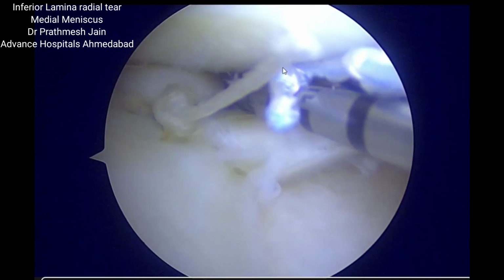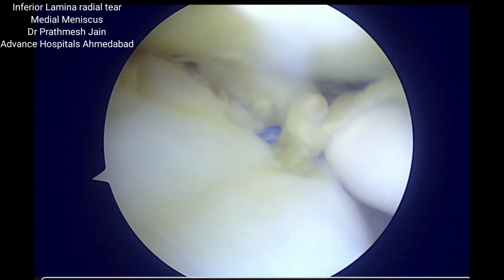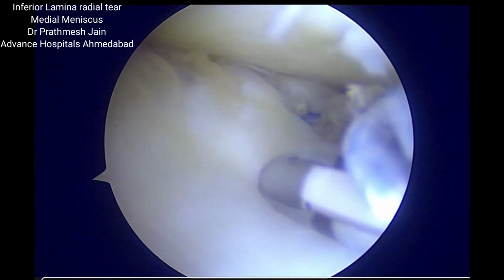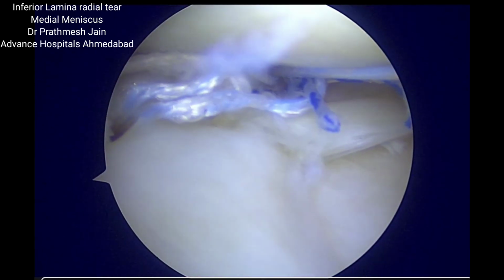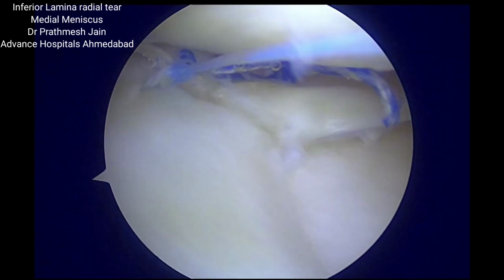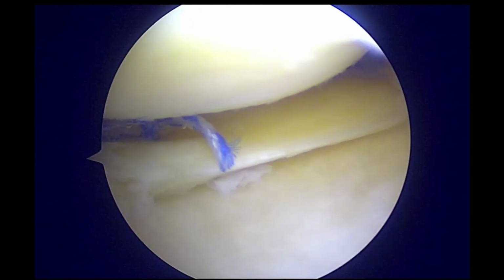So in this particular case we are using an all inside repair AIR device from Stryker and doing in the end the margin convergence from an AIR device, which will be a third suture closing the radial component of the tear, and this will lead to a good weight bearing capacity or the hoop stress loading capacity of the meniscus per se. So this is an important pattern of tear which we should identify and repair.